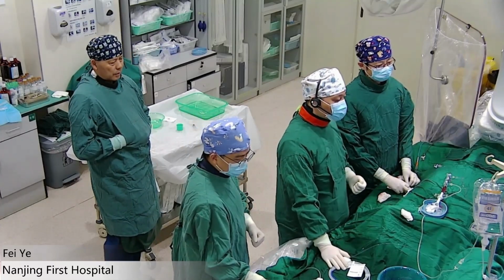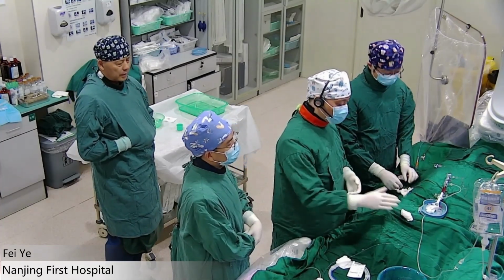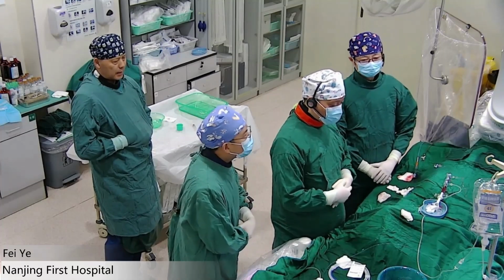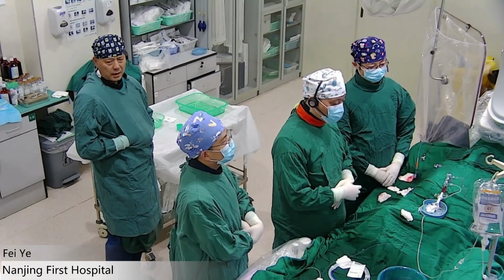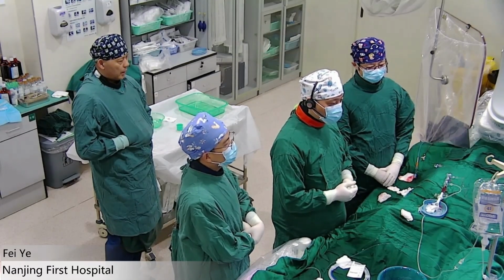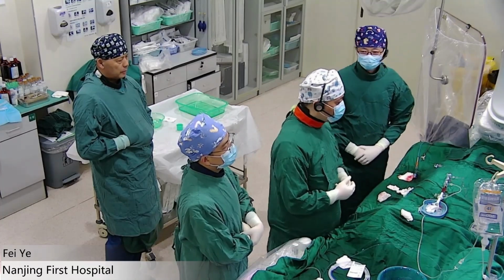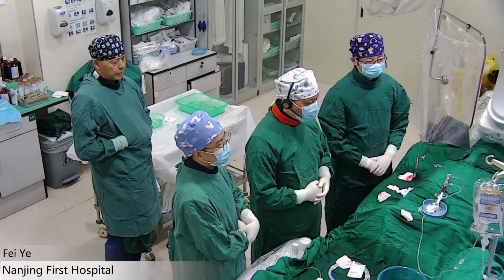Good morning, all my friends there. Today is the second case from China, a live case from Nanjing First Hospital of China. The whole operative team is Dr. Ye Fei, Dr. Wu, and Dr. Deng. Go ahead, please, Dr. Ye, to introduce the case.